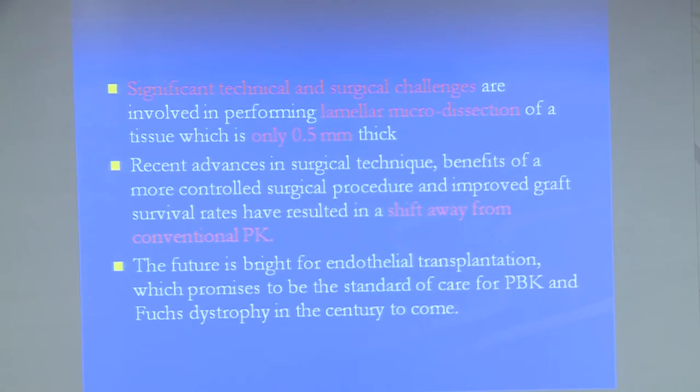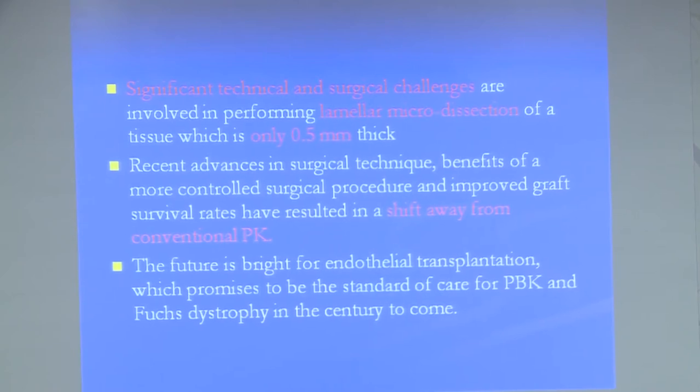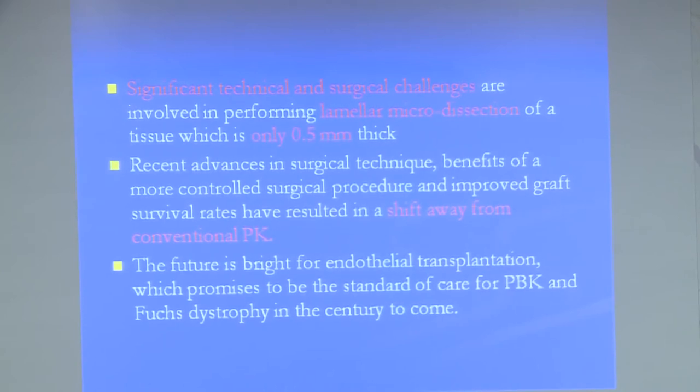There are significant technical and surgical challenges involved in performing lamellar microdissection of a tissue which is only 500 micron thick. Recent advances in surgical technique, the benefits of a more controlled surgical procedure, and improved graft survival rates have resulted in a shift away from conventional PK.